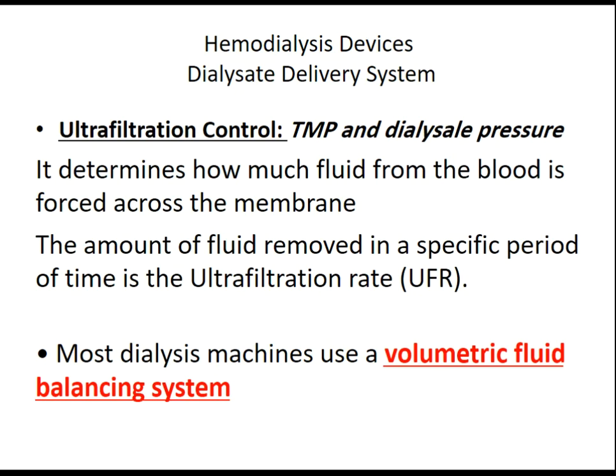The amount of fluid removed in a specific period of time is the ultrafiltration rate. Most dialysis machines use a system called a volumetric fluid balancing system.